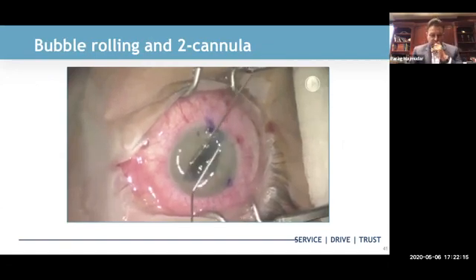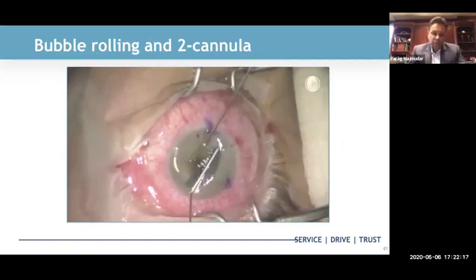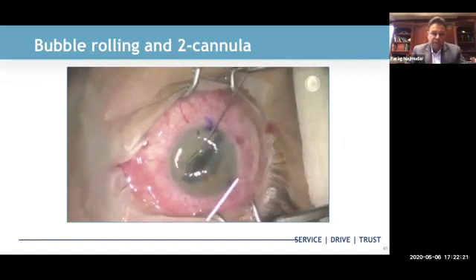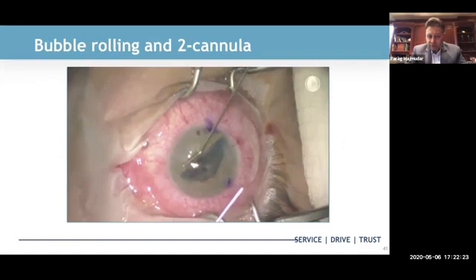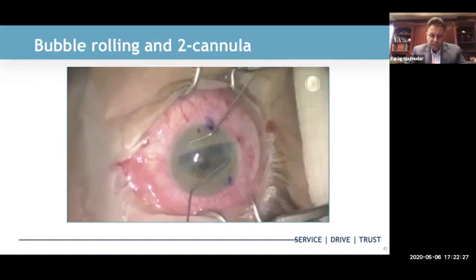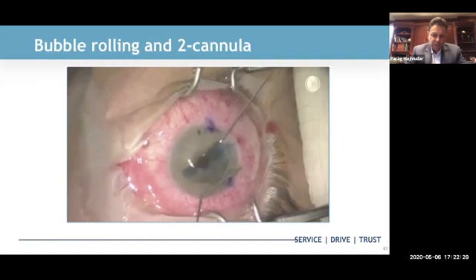The younger the donor, the more likely this is to happen. So we like to ask for donors that are over 40, 50 is even better. And most of them, frankly, fortunately are that age. But sometimes we get younger patients and we want younger donors. But sometimes you have to deal with tight scrolls like this.